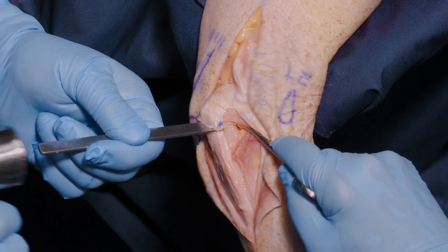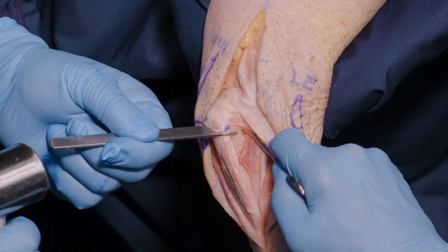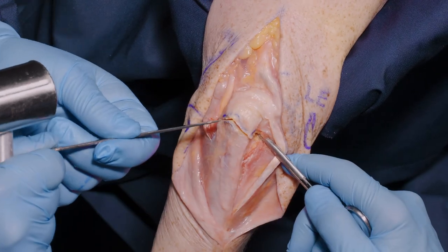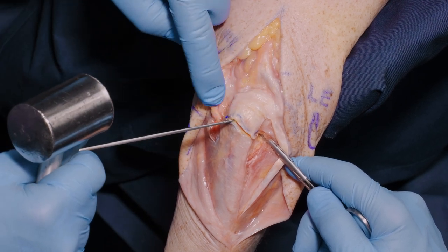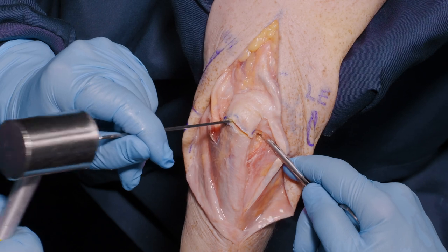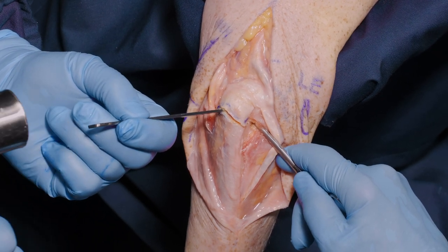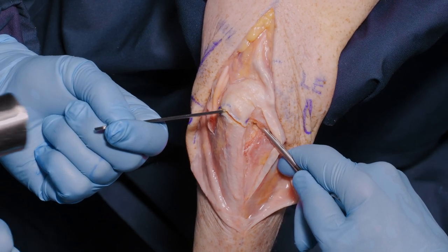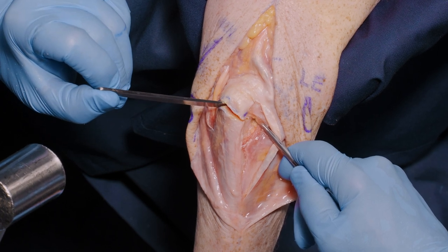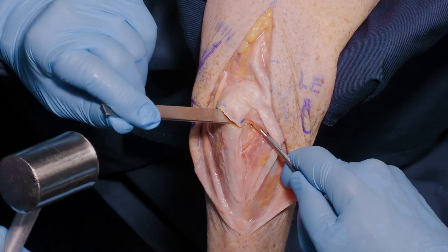The rest of the osteotomy is performed using an osteotome. The idea is that the cartilaginous surface close to the bare area will fracture according to its natural structure, rather than being imposed upon by the saw. We very gently continue until we're very close to the articular surface, then do the same on the ulnar side, making sure the ulnar nerve is away from harm. We listen for a change in tone and a slight gapping of the bone. Here you see the bone beginning to gap, and as we gently prise it apart, we hear the snap — the remaining bone fibers beginning to part company.